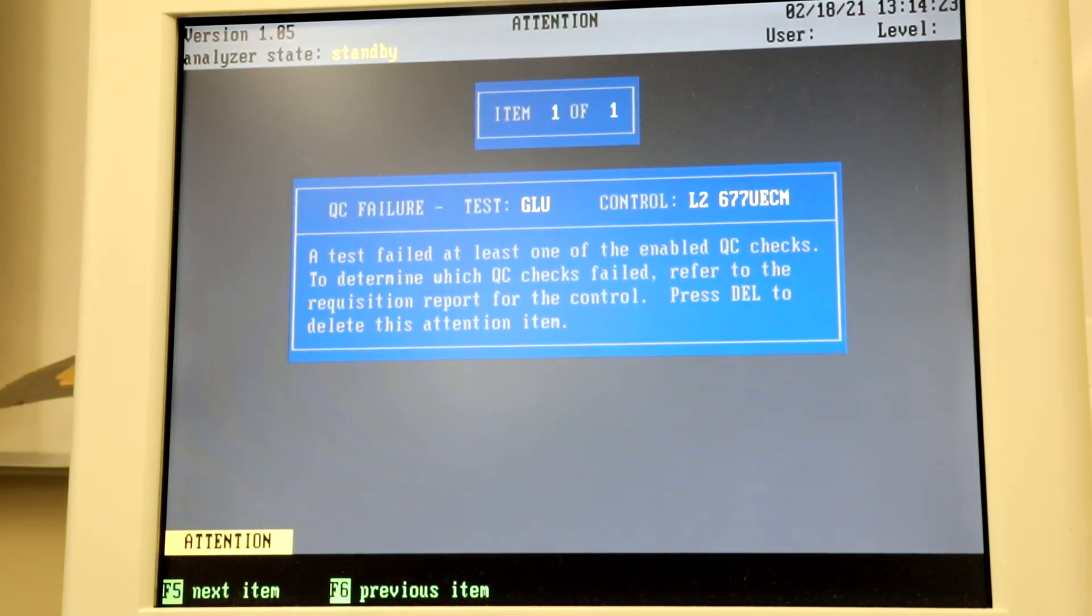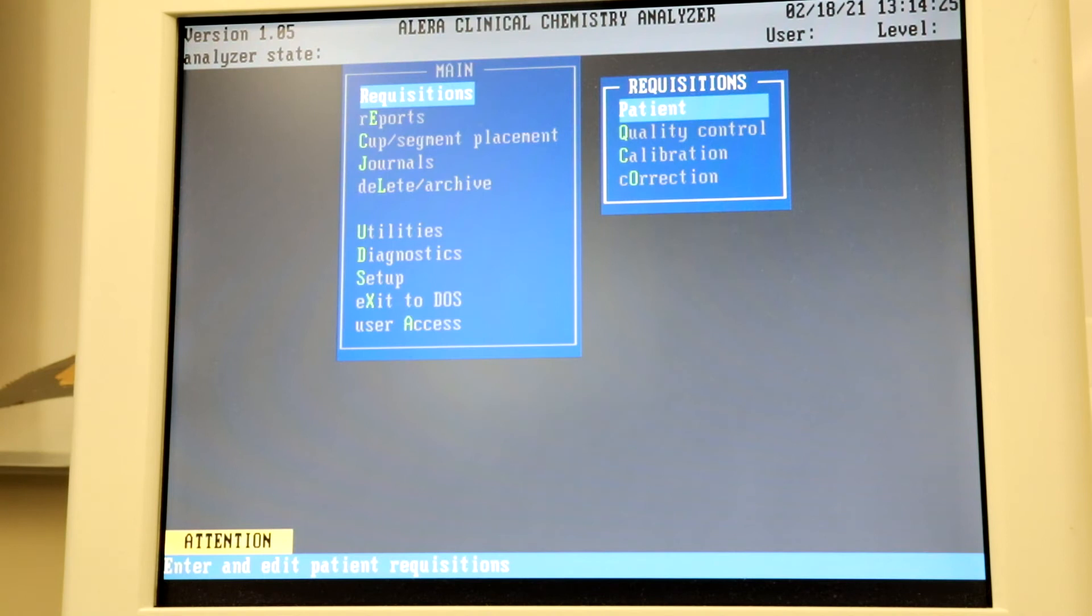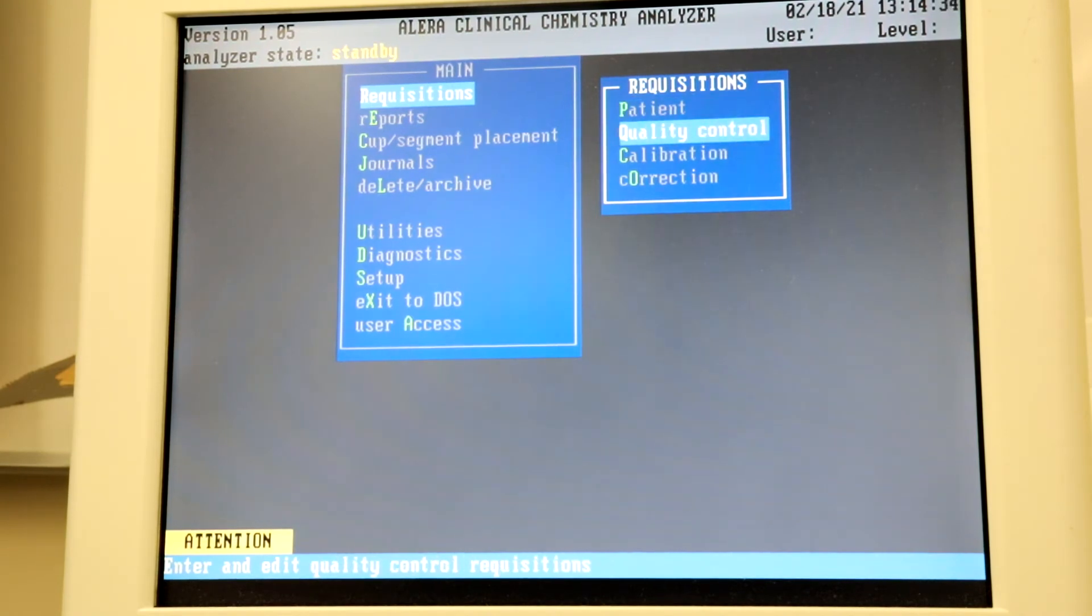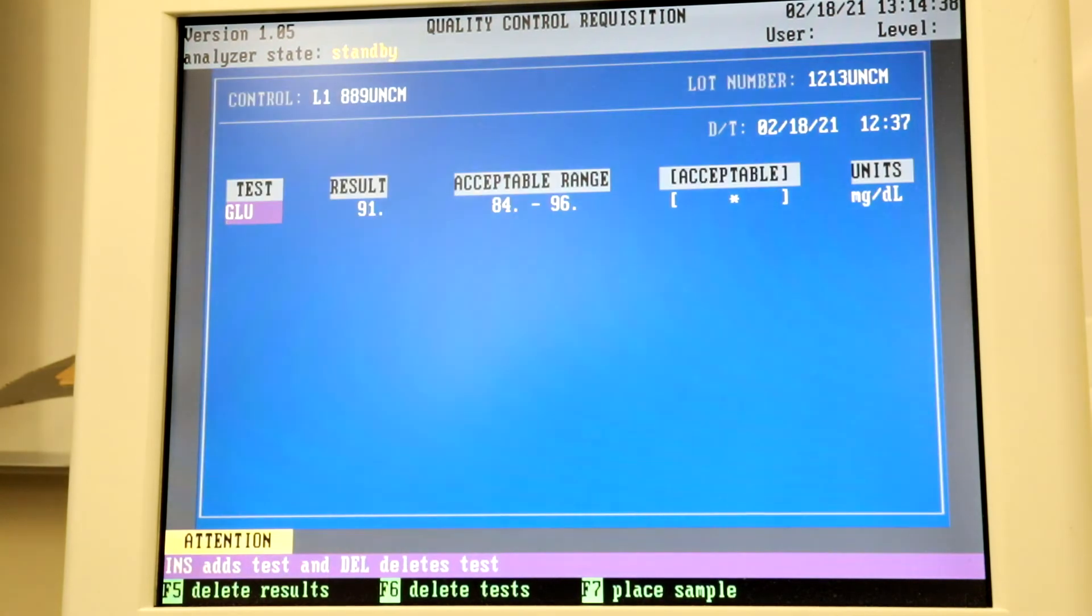To see the QC result, return to the main menu, select Requisitions, Quality Control, and then select each level to see the result.